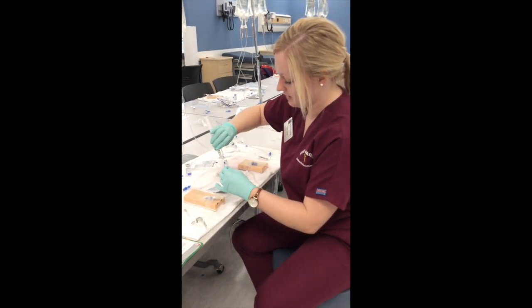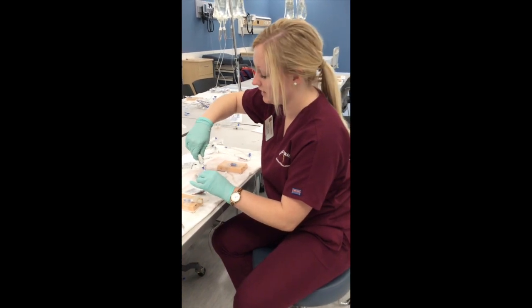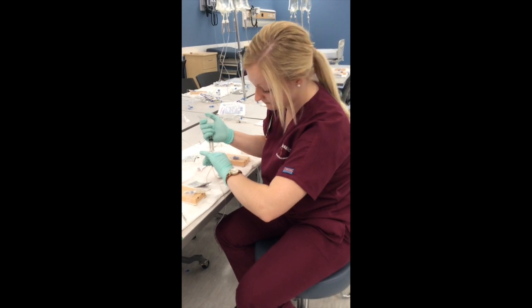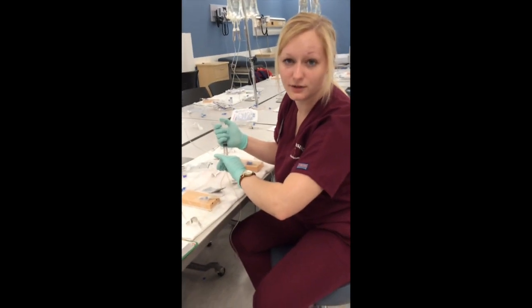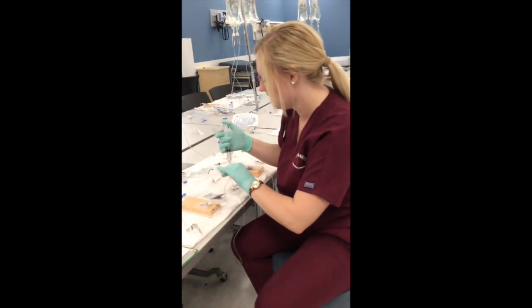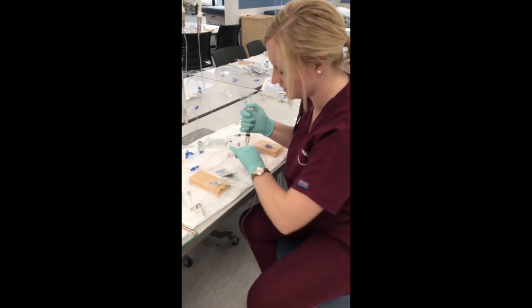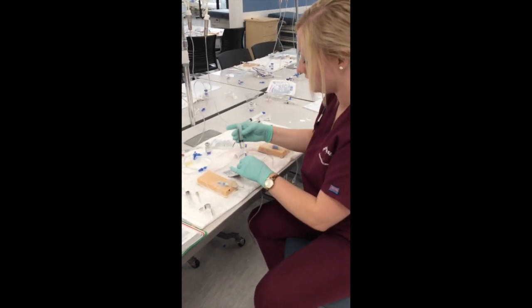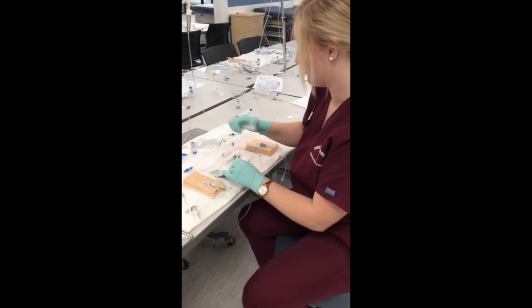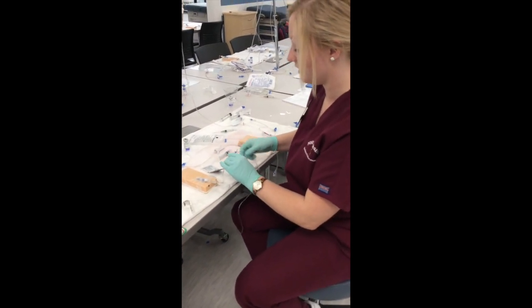Since my drug guide told me I need to infuse this morphine over 5 minutes, I'm going to infuse it really slowly over 5 minutes, but not for real. In real life I would, but since right now we're in the videos, I'm not going to do that. So, like I said, I will have been infusing this over 5 minutes, and whenever I'm done, I'm going to get my saline flush, and I'm going to flush it, and then I'm going to let it flow again.